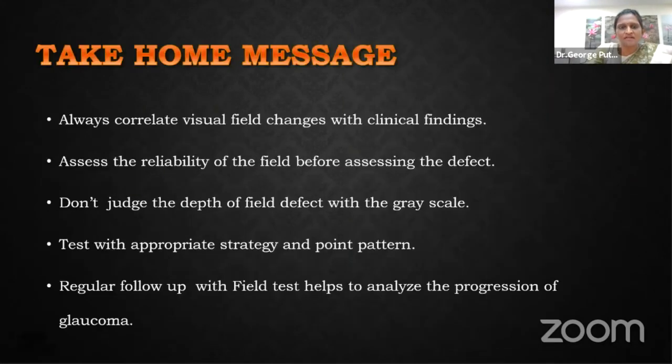So with this, since the time is up, always correlate the visual fields with the clinical findings, reliability should be assessed, and don't judge the depth with the grayscale, and test with an appropriate strategy and point pattern. And regular follow-up is needed to assess the progression.